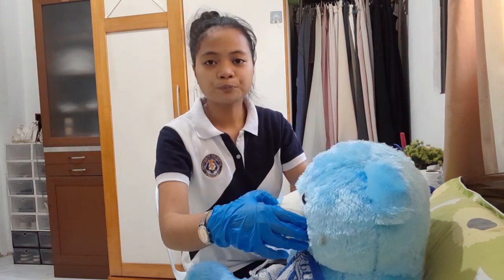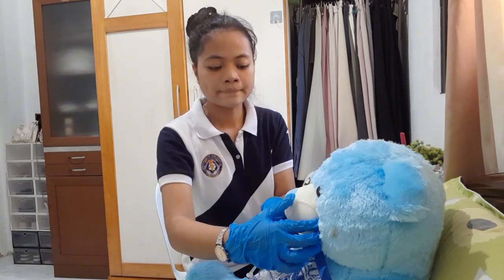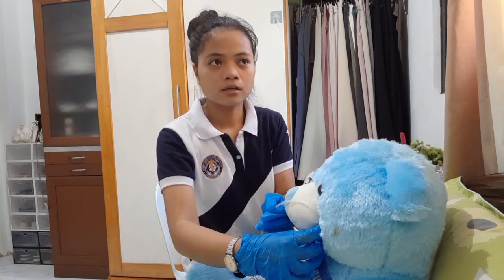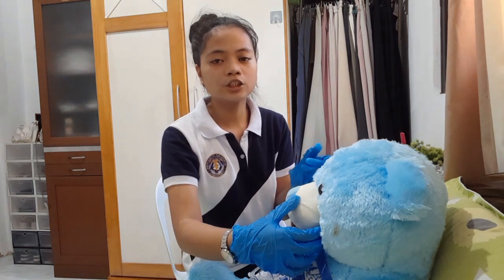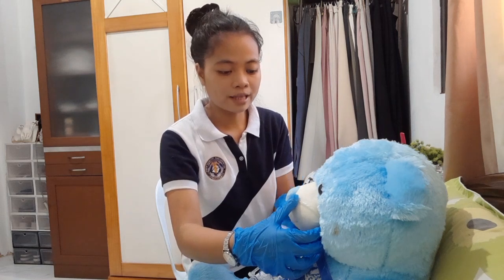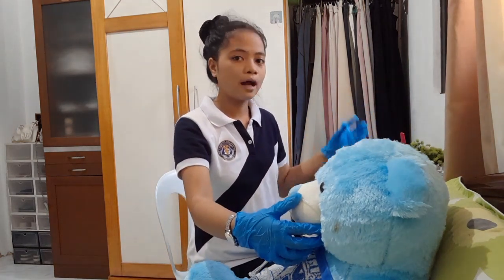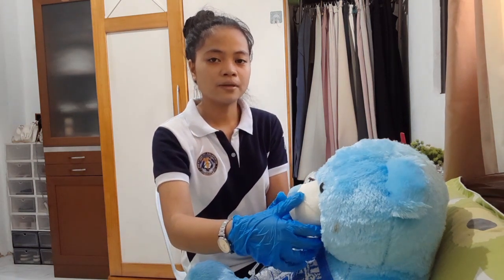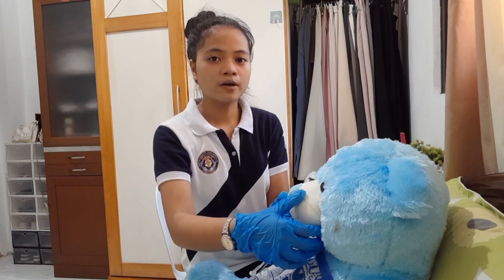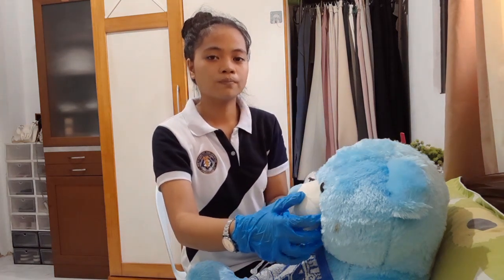Then after that, we're going to instruct the client to swallow as the tube advances. So we're going to use a cup with straw. So papasipin po natin sa patient ng straw while swallowing. So we're going to insert the tube.